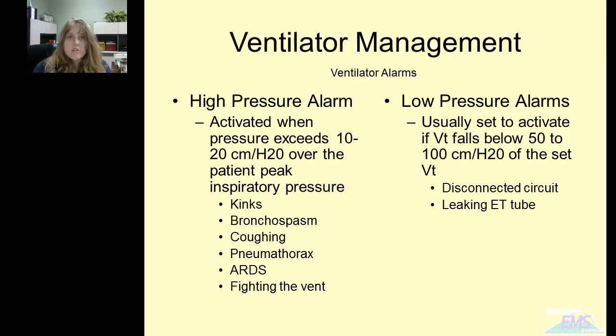Now, if your patient has ARDS, adult respiratory distress syndrome, there's a good chance you're going to have to adjust those high pressure alarms, or those peak inspiratory pressure alerts, because those individuals' lungs are collapsed and it takes higher pressures to keep that lung tissue open. You just need to understand that it creates a situation where you lose the surfactant and you have atelectasis, where the alveoli are sticking together. The other case is maybe your patient is coming out of sedation and starting to fight the vent, trying to react or respond to what the vent is doing to them.